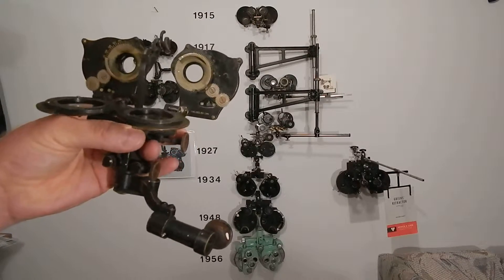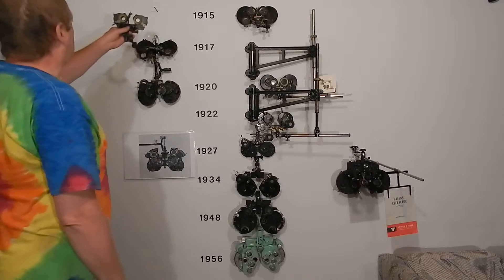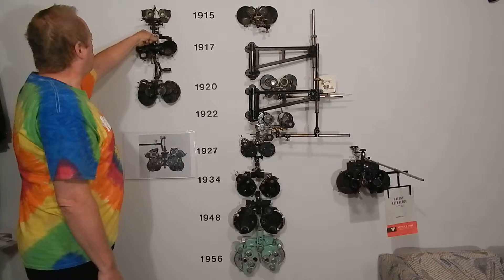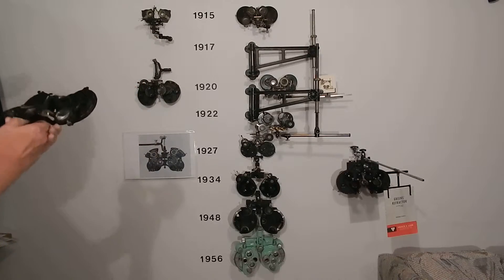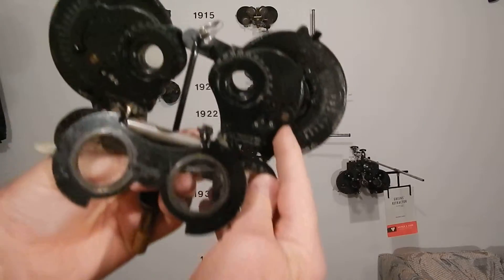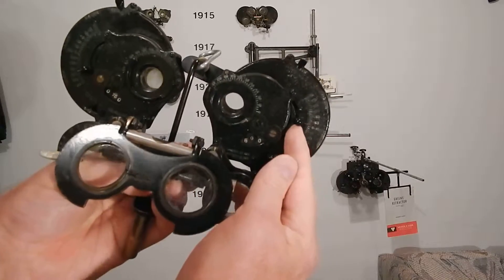Somebody named Michael Wolfe, who also lived in New York City — he lived in Manhattan — liked it so much he decided to buy him out. But he had his own patent. Now, this is a Wolfsky optometer. If you look at this, you see this mechanism in the front. This is exactly the same as the Chagun — it's the same.